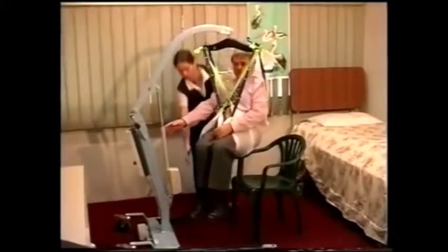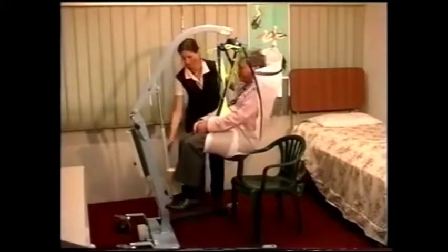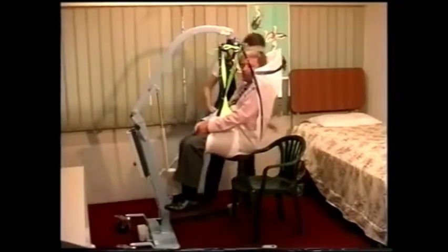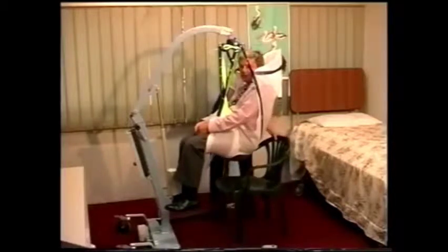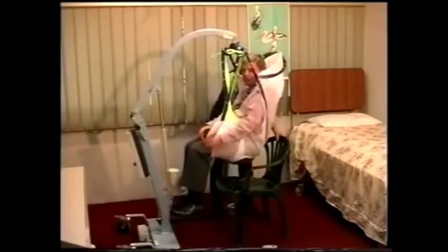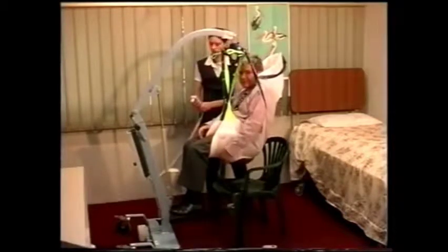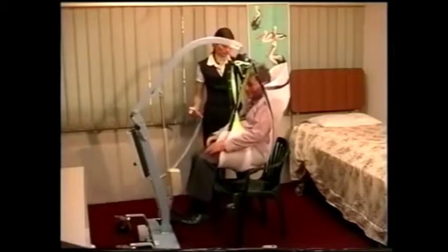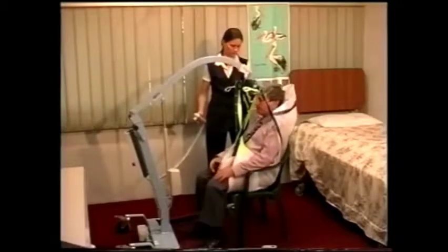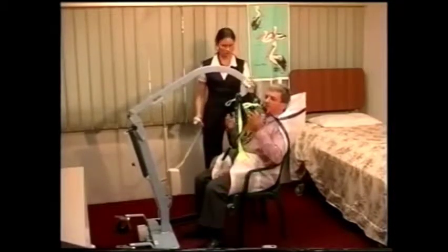If you just turn me around sideways. Now will I go back down to the chair? And if you position the chair correctly, there may not be any need for holding the strap again. And you can see the toileting hole just there. So if I was going onto a toilet, you can lower me down. That's not bad. Yep. Rightio.